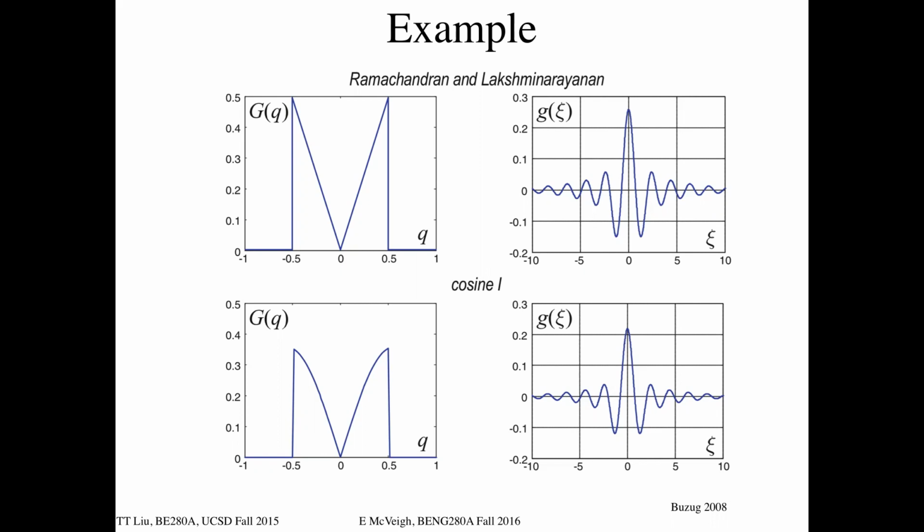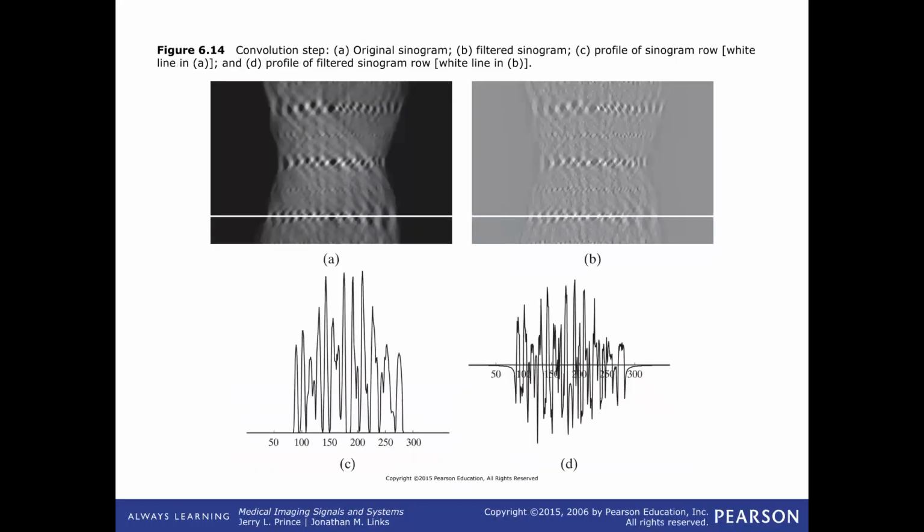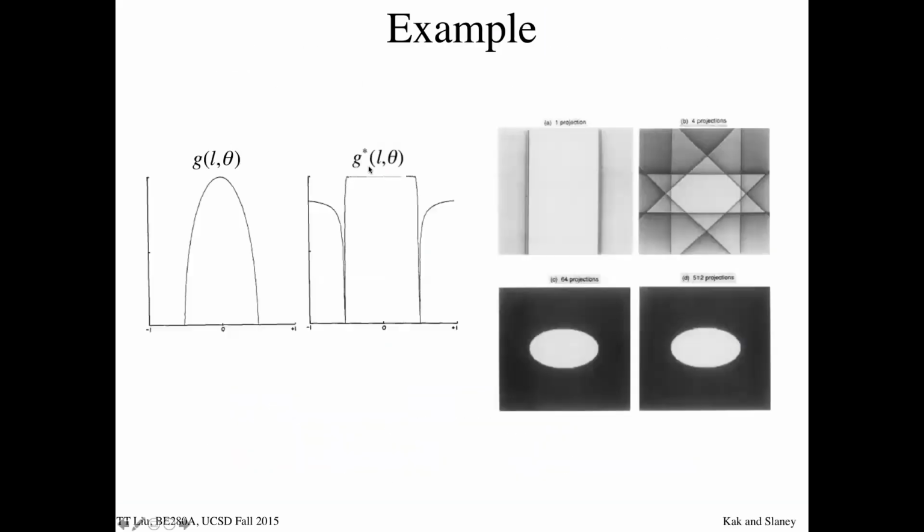And you can see that if we go back to this, right? So what did convolution do? Well, it really boosted making this edge, right? So as these negative lobes sort of scooch along edges, it's going to subtract away all the stuff that was blurred out, right?